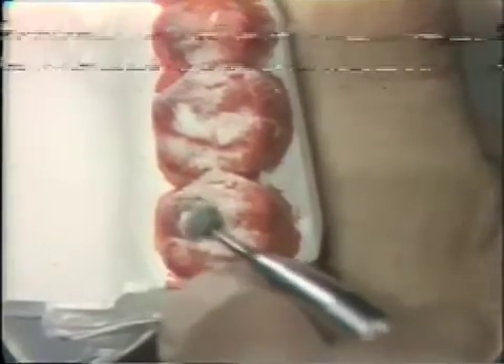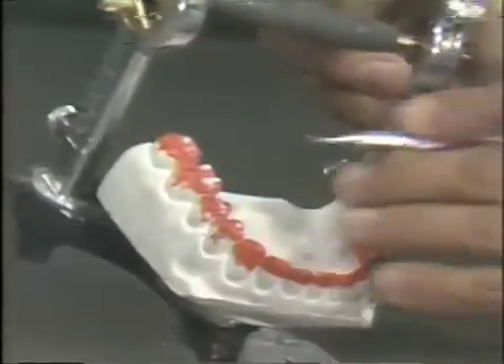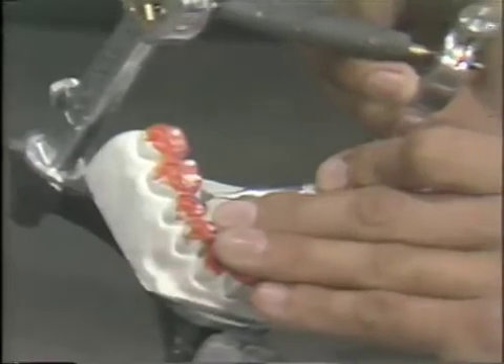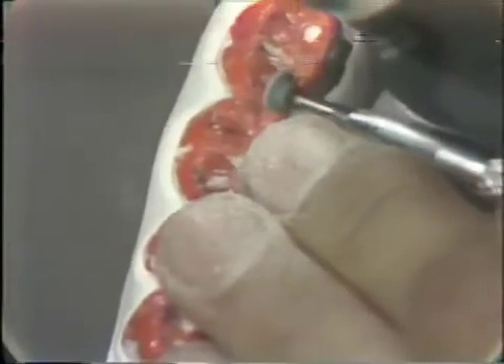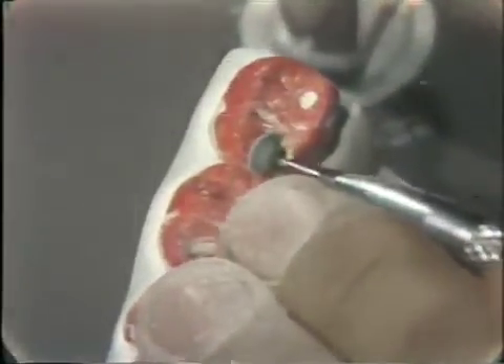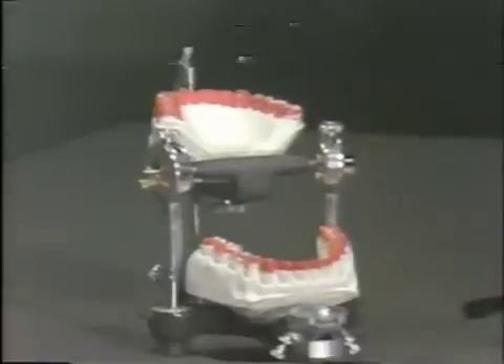On the mandible, we don't have anything to remove in the molar area because we said this is an area that we do not grind. Here we have the other aspect of the BULL rule. We will take something off the lingual of the lower, again in the same direction as the mark. There is no point in just going in there and haphazardly cutting this off. One should know the exact direction that the mark is traveling and reduce it in that particular direction to assure that the contacts will clear each other with a minimal amount of reduction.